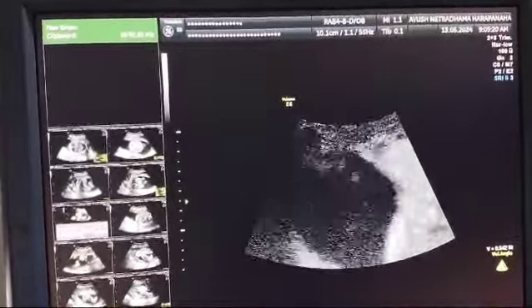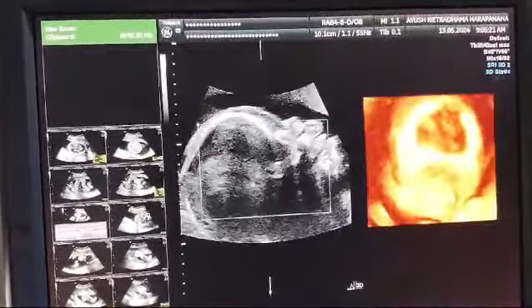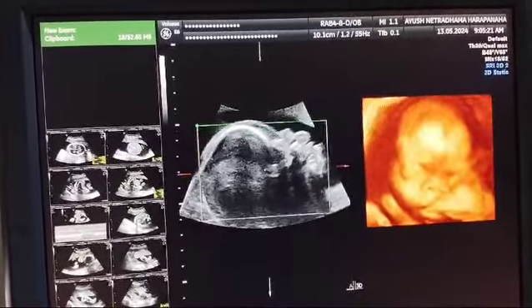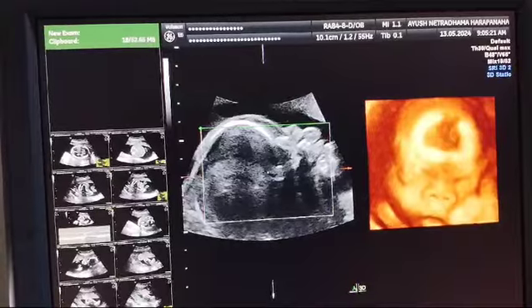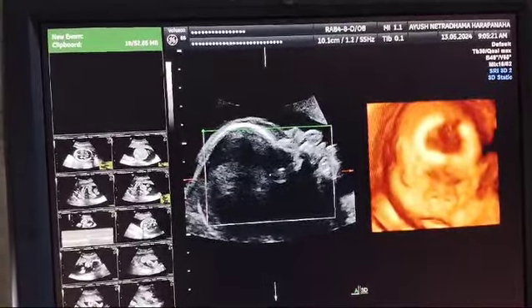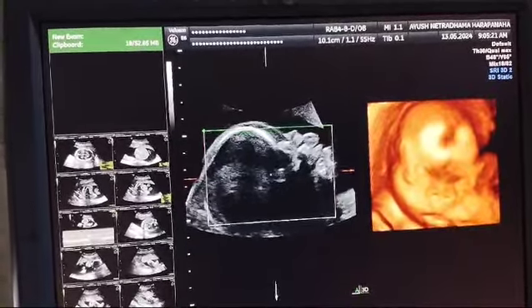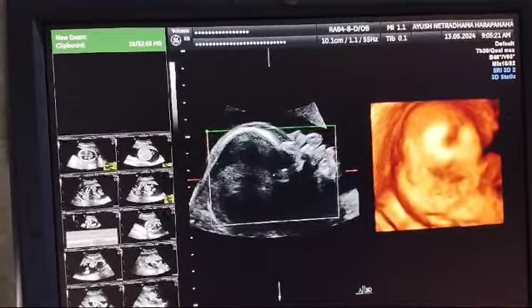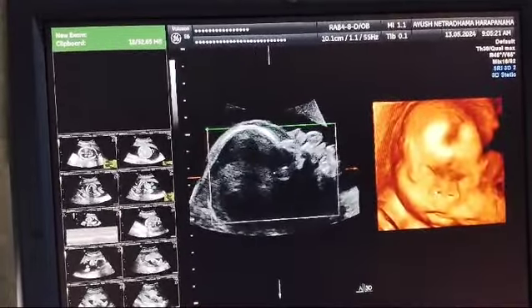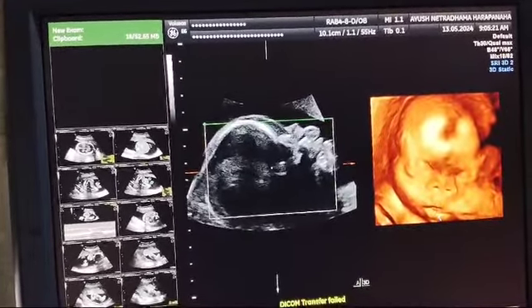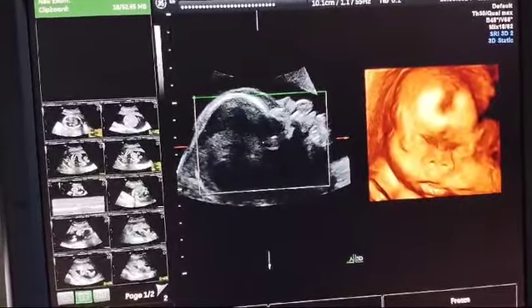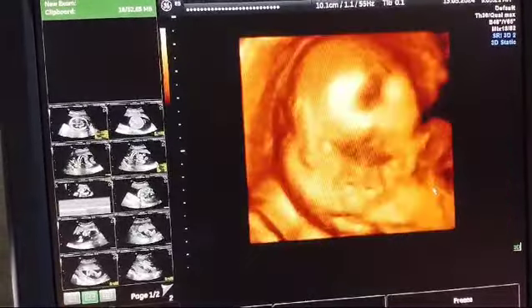This is a mid-sagittal 3D scan where you can see the facial profile showing frontal bossing and an upturned nose. You can see the nostrils, thick lips, and a tongue which is protruding — all visible on this 3D image.